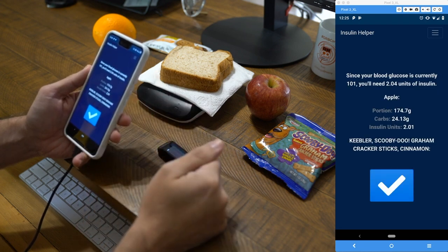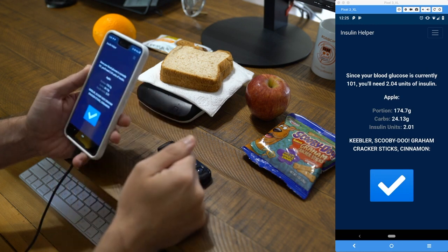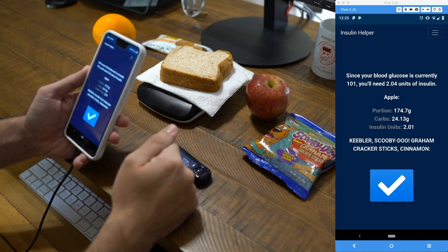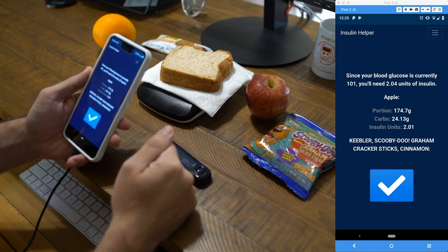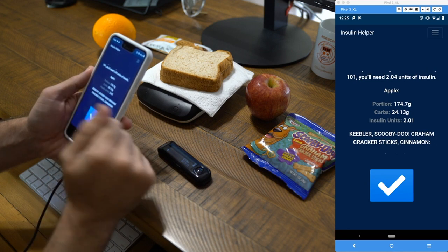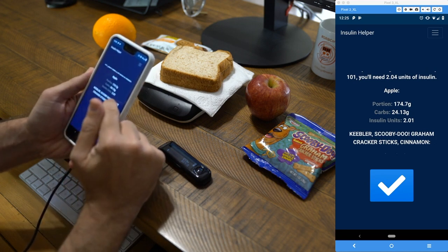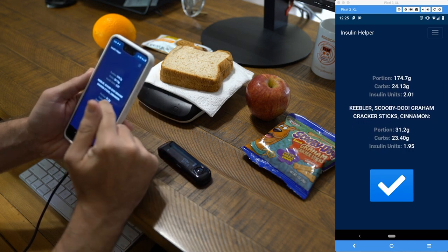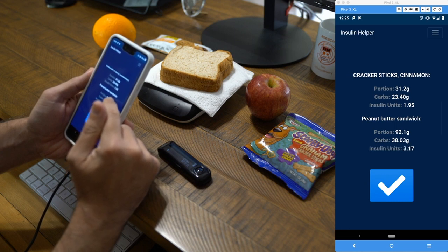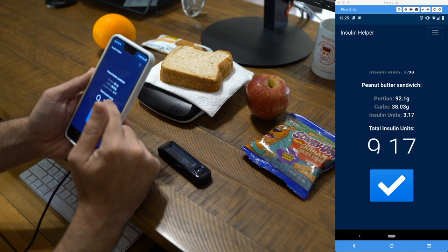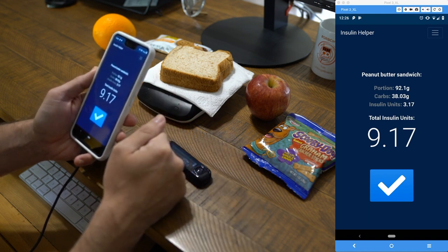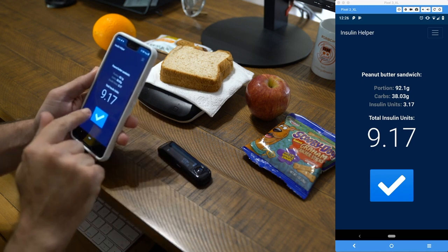Now we go to our summary. Based on the formula, since our blood glucose is 101, we need 2.04 units of insulin as our coverage dose — the dose based on our blood sugar. It then breaks down each food: the apple at 174 grams contains 24 grams of carbs, calculating to 2.01 insulin units. The Scooby-Doo snacks have 23.40 grams of carbs, adding another 1.95 units. The peanut butter sandwich is 38 grams of carbs. Our total insulin dosage based on all inputs and the formula is 9.17 insulin units. We save that by clicking the check mark.